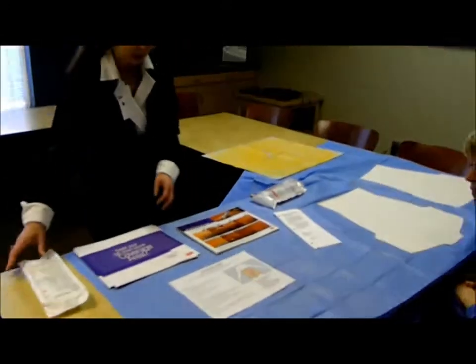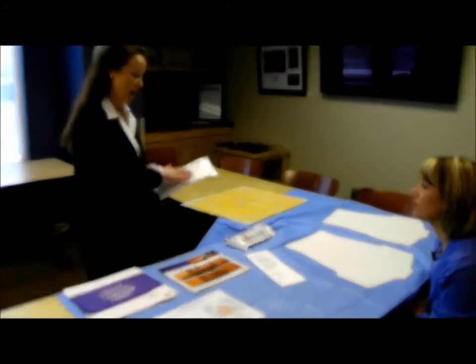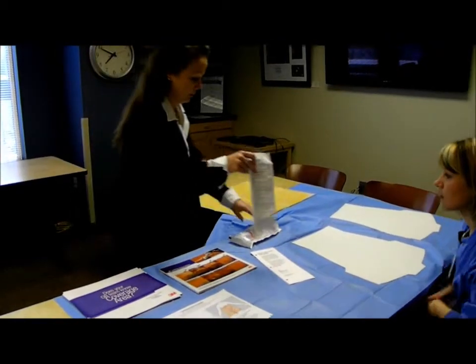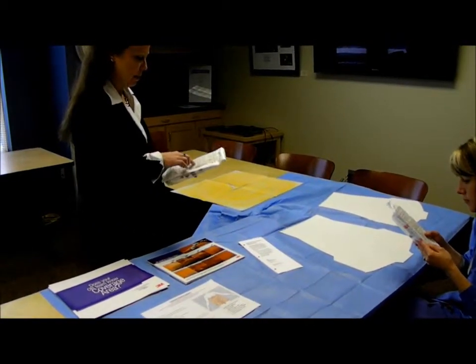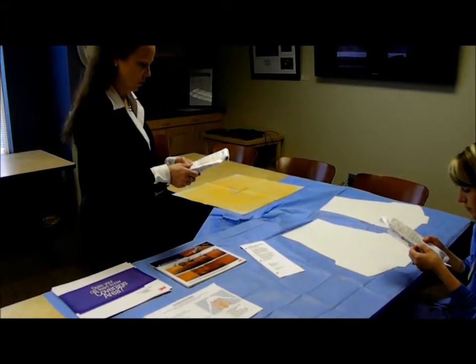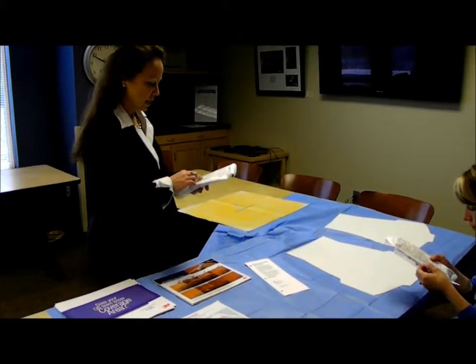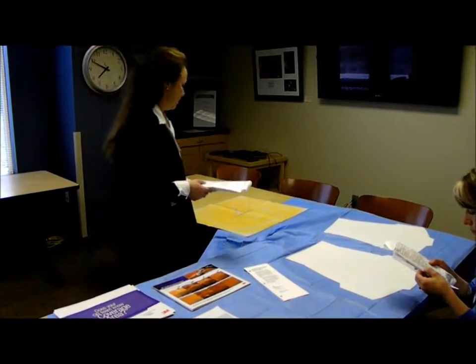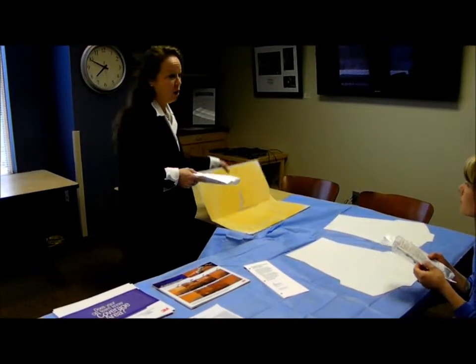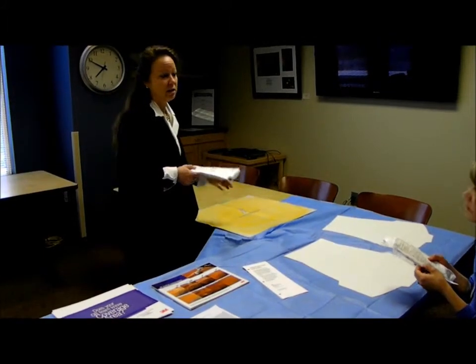Great. So I always like to start out with having people read the instructions on the package insert or the instructions for use. So if you want to go to directions kind of in the middle of your page there, and we'll just follow through, and you're free to take these also if you'd like. So at the end, we want to discard any solution that we don't use. So while we do have this coverage area, we might not be covering all of this area. So don't feel like you have to use the entire solution.